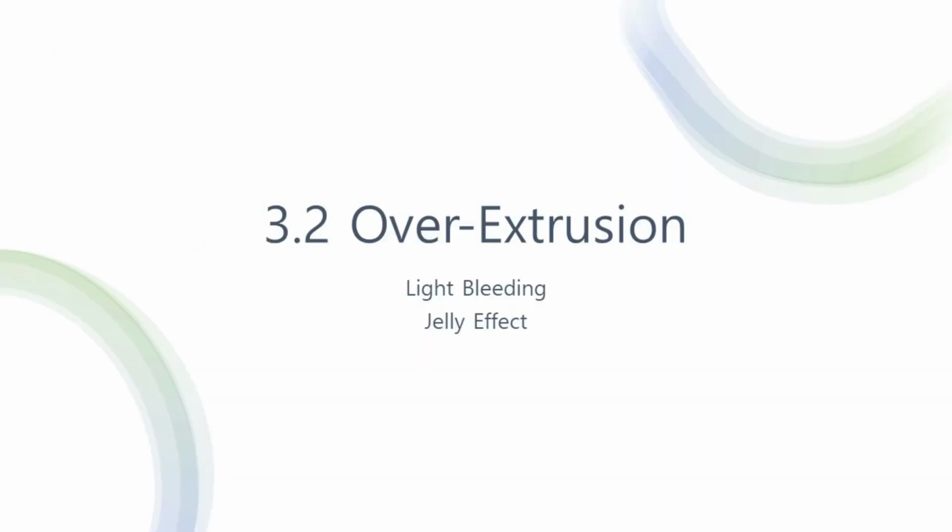However, there's another factor to consider while addressing the problem of polymerization shrinkage. As I mentioned earlier, this involves the commonly encountered issue in 3D printing: over-extrusion. This phenomenon occurs when an excess amount of resin is printed, leading to the crown being thicker than intended. Over-extrusion occurs when more material is printed out to the sides than is necessary during the printing process.